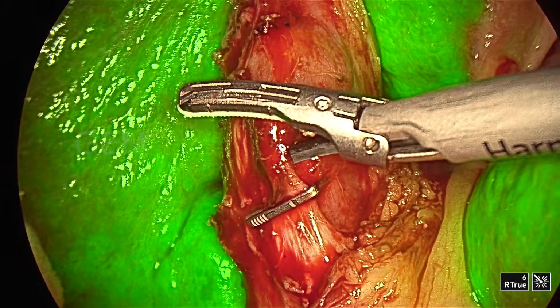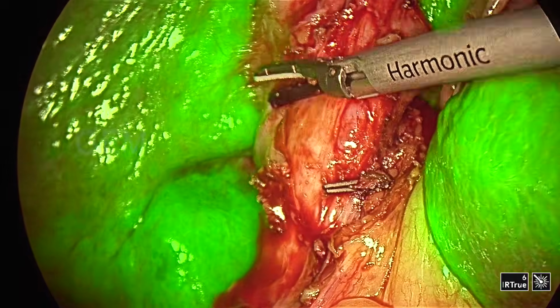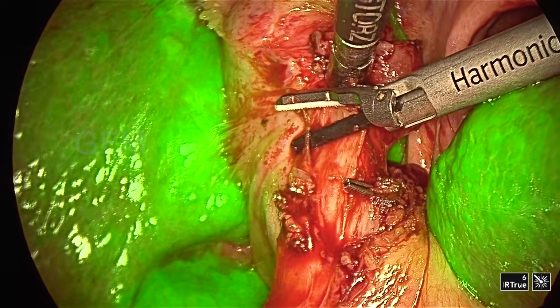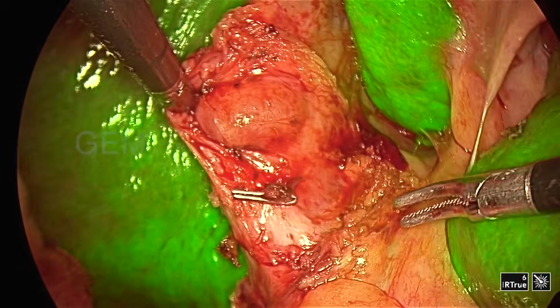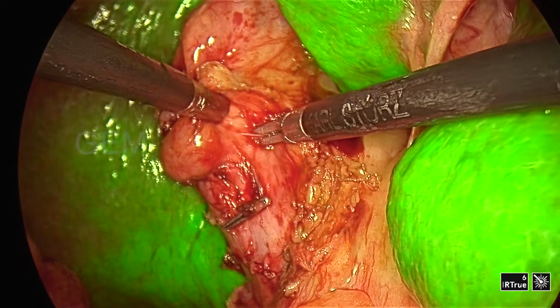So I have to go down, and I'm dissecting there. That area is like a wide cystic duct. It looks like an infundibulocystic junction. It's not a contracted area, it is very wide. You can see the ICG mode is helping me a lot.